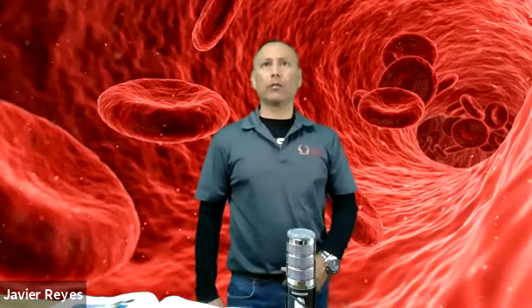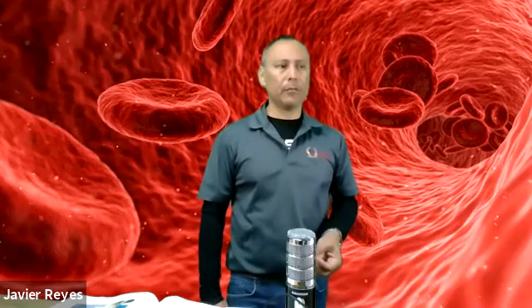Now, there are four steps for the capillary puncture that are the same as a vein puncture. Remember, you have to have your requisition, right? You have to introduce yourself, get consent, and so on. So the first four steps are skipped. So review and accession test request, approach and identify the patient, prepare the patient for the procedure if they understand. If it's a child, you talk to the caregiver. Verify any dietary restrictions, latex allergies, surgeries, and anticipate any possible complications if they have a history of fainting or fear of blood or whatever the case may be. Make sure that you prepare for that. All right.